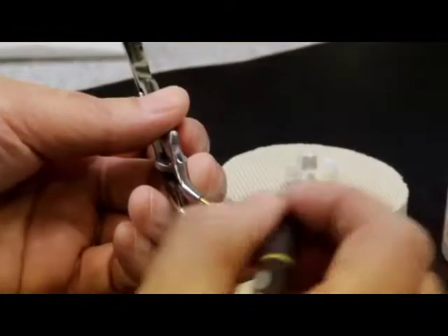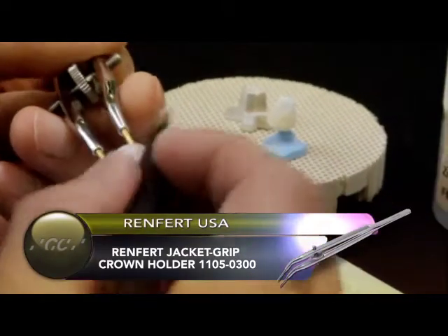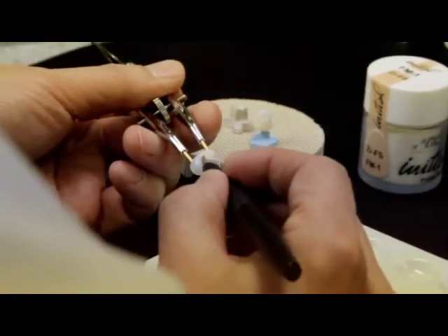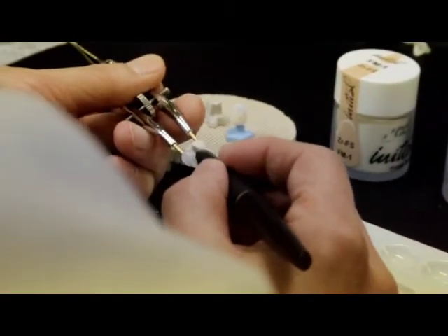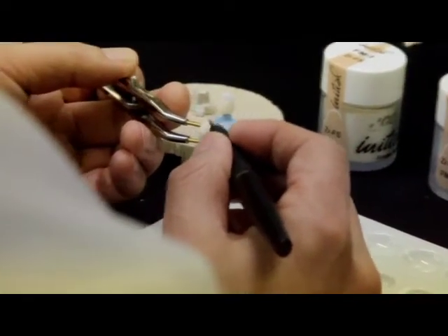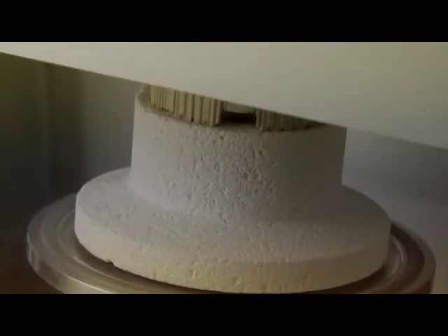For zirconia substructures, it is recommended to use a pre-colored zirconium dioxide framework. The pre-colored zirconium frame structures can be changed in color and fluorescence by applying a thin wash layer of power frame modifiers. Power frame modifiers should be fired at 900 degrees Celsius.